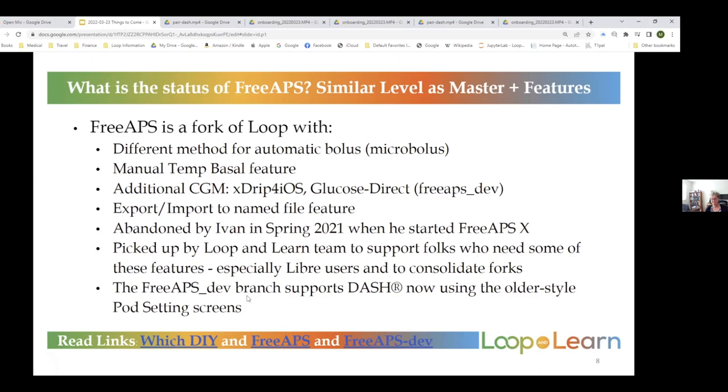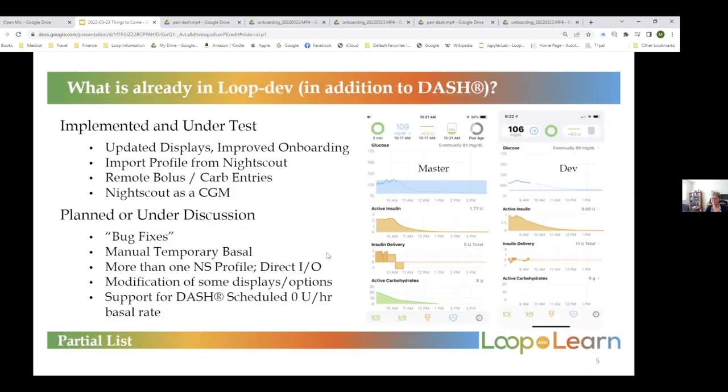The FreeAPS dev branch has Dash added, but it has all the old pod screens — just like the Eros pod screens, not like the fancy new ones you just saw under loop dev. If you do want to go ahead with FreeAPS dev, please read the links for DIY FreeAPS and FreeAPS dev. These charts are going to be posted on the Loop and Learn site, so you'll be able to get access to them after today.